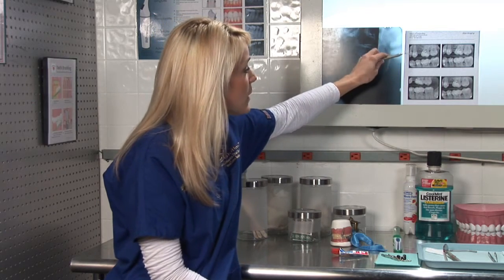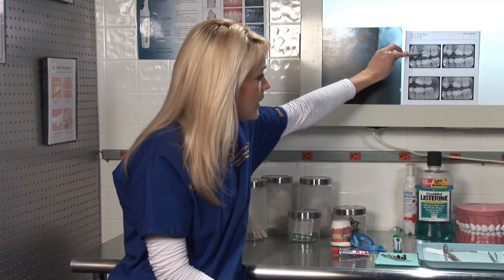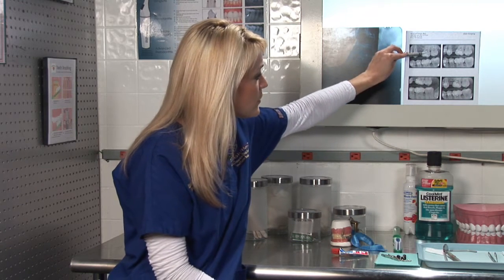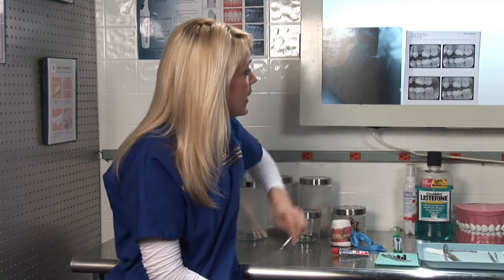When looking at the x-rays, you look in between the teeth where you see the little gap, and if there's any darkness around the side of the tooth, that's usually an indication that you have a cavity. For children, we take only two bite wing x-rays because their mouth is much smaller than adults.